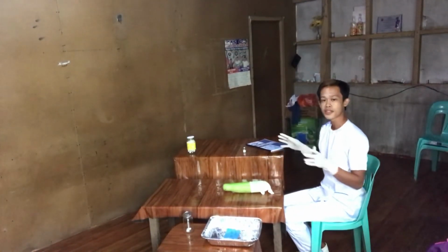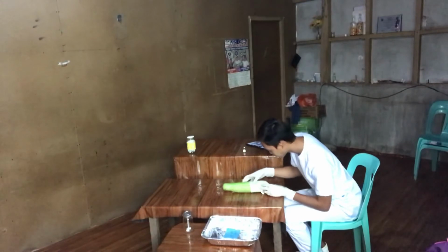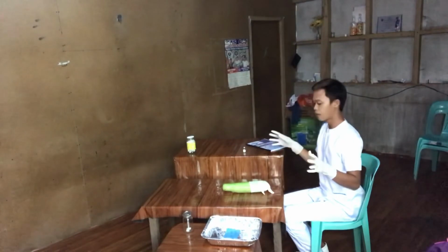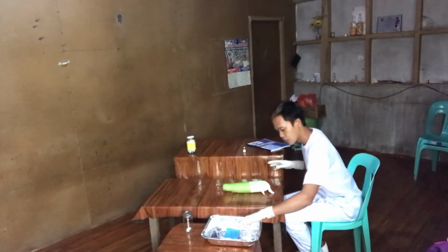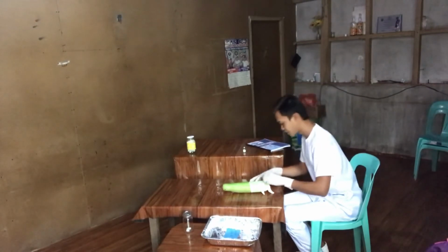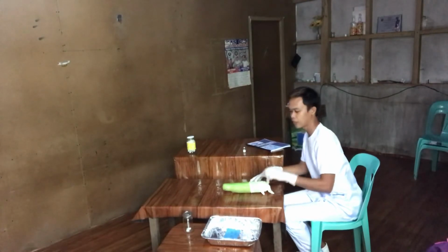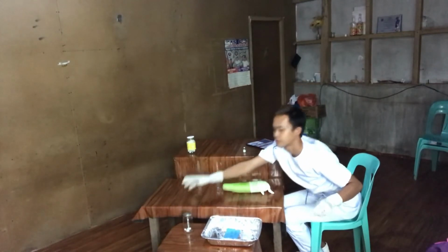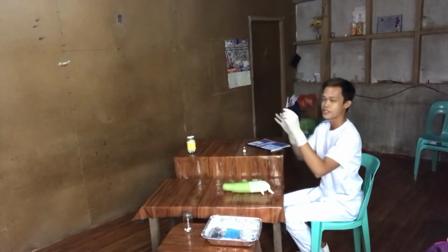Next, we're going to choose an injection site free of lesions and discolorations. Then we're going to use an antiseptic swab to clean the site we're going to inject, using a cotton ball soaked with alcohol, and we're going to wipe it in a circular motion. After that, we're going to dispose of it in the waste receptacle. For this time, we're going to remove the cap of the injection.